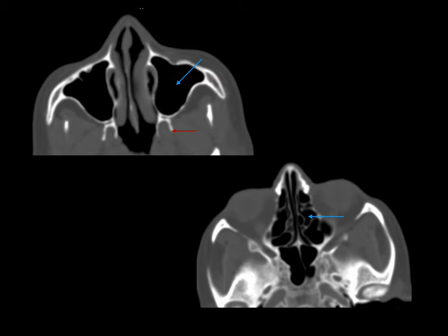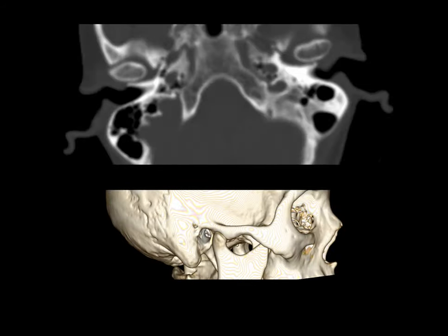Coming to the paranasal sinuses, look at the pterygoid plates — fractures there are very common. Sinus opacification, hemomastoid, and hemosinus may be present; look at the bilateral ethmoid and sphenoid sinuses. The temporomandibular joints are very important — check whether the condyles are within the TMJ fossa, and 3D imaging helps assess whether the condyles are in position.